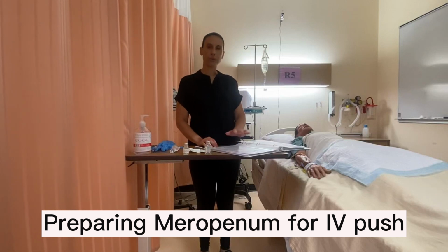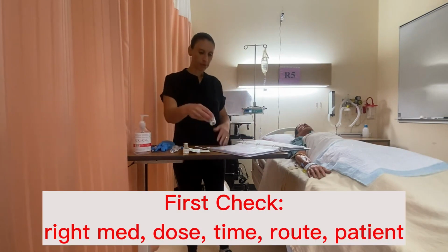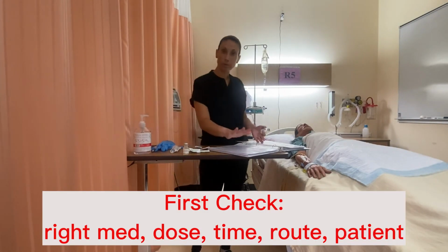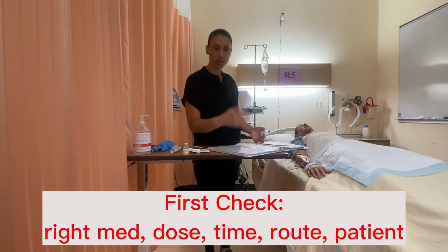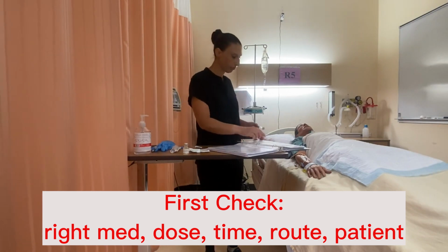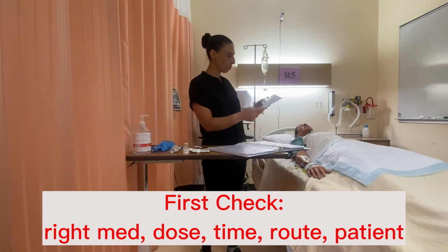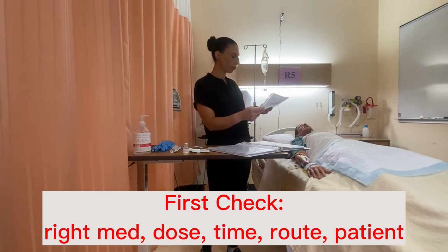This video will review mixing an IV push medication. So I'm going to do my first check here and also review my PDM to make sure that I, as a student nurse, can give this medication, which is meropenem, so verifying the name. And also turning to my MAR, make sure that I have the order for meropenem 500 milligrams.